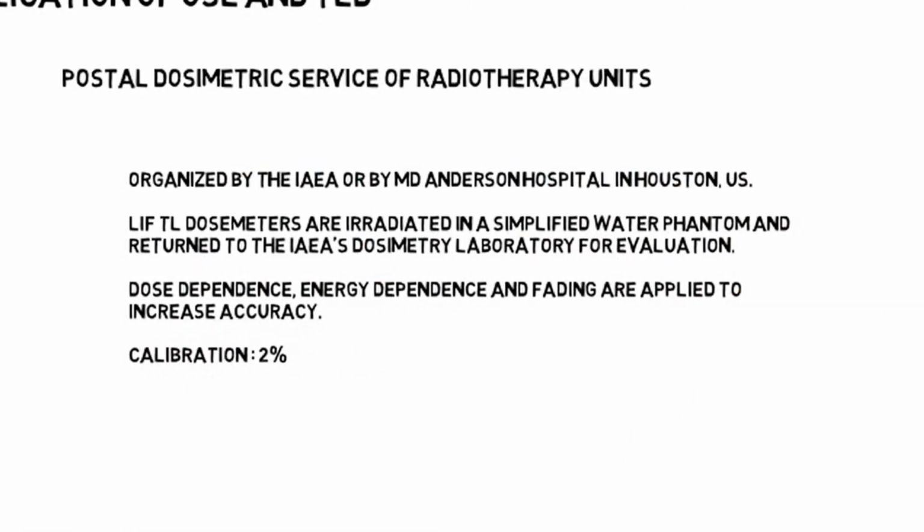The lithium fluoride TLDs are irradiated under specific conditions in a simplified water phantom at the participating radiotherapy center and returned to the IAEA dosimetry lab for evaluation. Several corrections for dose dependence, energy dependence for MV X-ray, and fading are applied to increase accuracy. The accuracy of the measurement can be better than 1%, but the overall extended uncertainty of the method, including the calibration, is about the level of 2%.